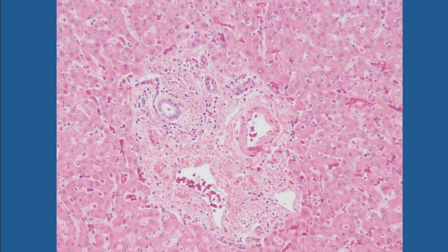This is known as the hepatic arterial buffer response, and it is something that has been shown both in animals as well as humans during surgery, but we have never really looked at it pathologically. But here is a fine example of portal vein thrombosis, which is extrahepatic. I know that this is not thrombosed, but the extrahepatic portal vein was thrombosed, and there are effects in the portal vein within the liver. And the hepatic artery here is thickened and dilated.